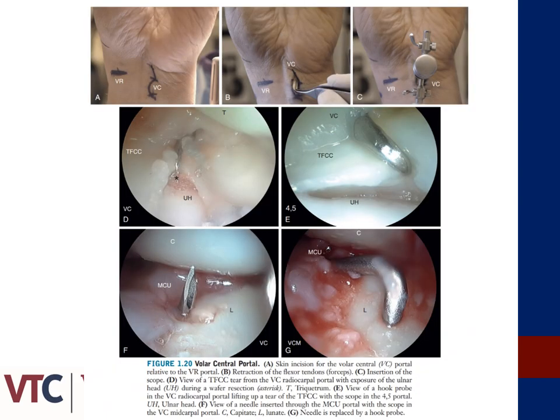The images along the top represent development of the volar central or volar ulnar portal, which is developed utilizing an extended incision secondary to the lack of safe zone due to cutaneous nerves in this region. The flexor tendons to the fingers are retracted radially. A helpful anatomic landmark is the third intermetacarpal space, and this portal should be developed in line with it. Figure D demonstrates a TFCC tear as viewed through the volar portal, while figure E represents a probe through the volar portal identifying and further mobilizing that TFCC tear.